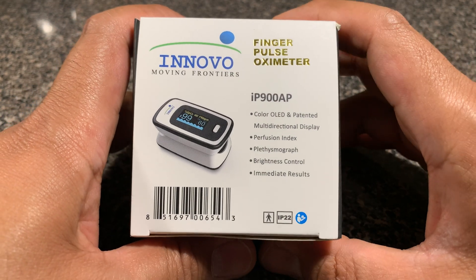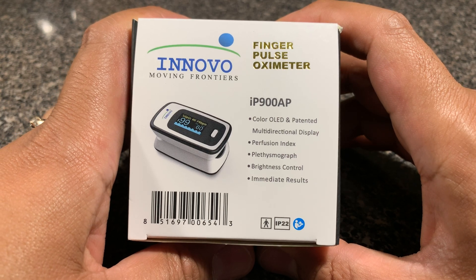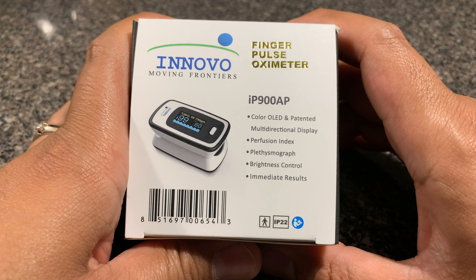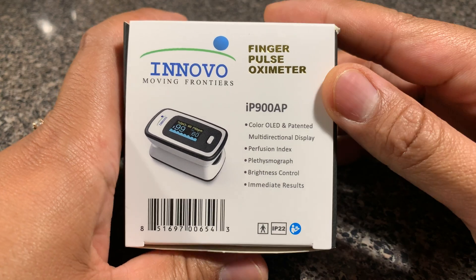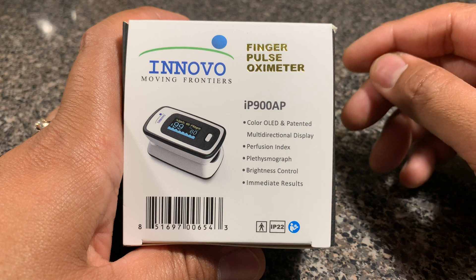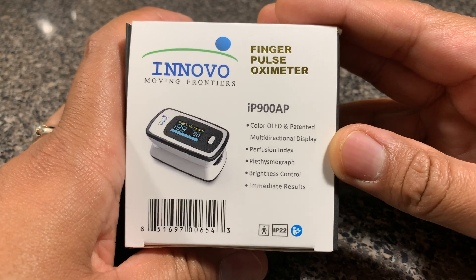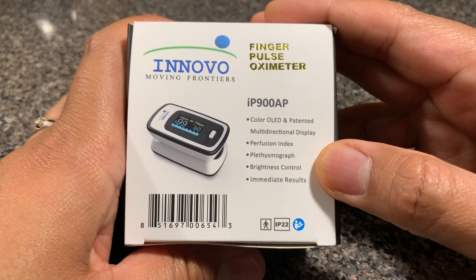Hi YouTube, I'm back with yet another product video. This time it's the Innovo Finger Pulse Oximeter IP900AP. This is a product that I recently picked up. Over the last year or so, since COVID-19 has been raging around the world, oximeters have been a popular device. What this device essentially does is check the amount of oxygen that's flowing through your bloodstream — or in other words, the ability of your lungs to pump in enough oxygen into your body. It can also read your pulse rate.